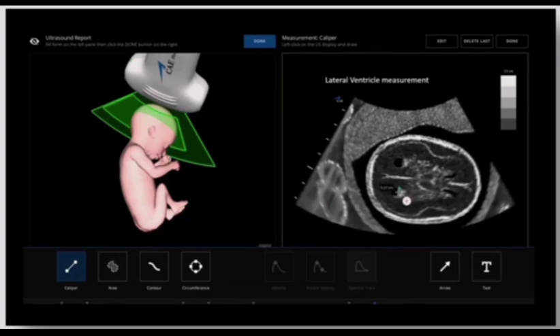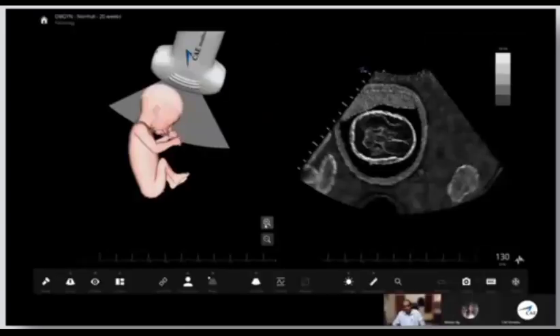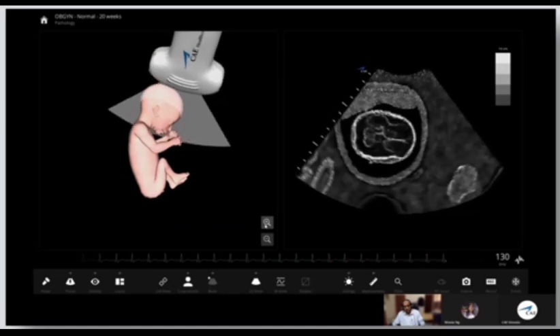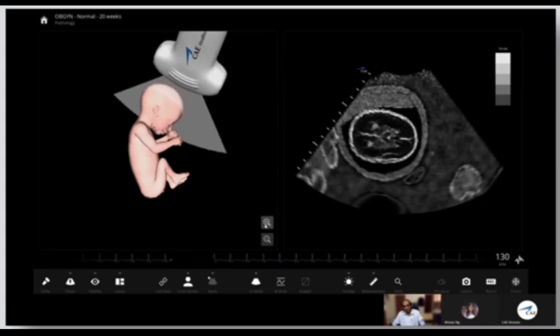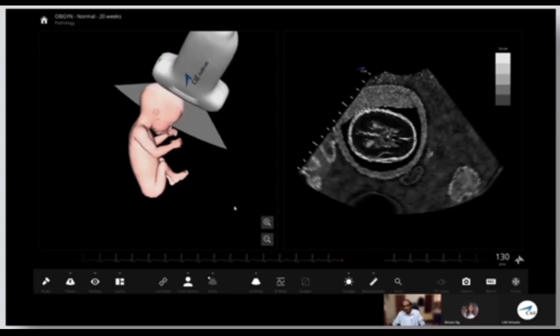I'm going to use the inner to inner measurement of the lateral ventricle at the level of the glomus of the choroid plexus. And at this point, you will also see the parieto-occipital fissure there. The biometric measurements we have completed. So this is how the transcerebellar plane is rotating, and you go upwards with the beam to show you the transventricular plane, and now you are in the transthalamic plane.